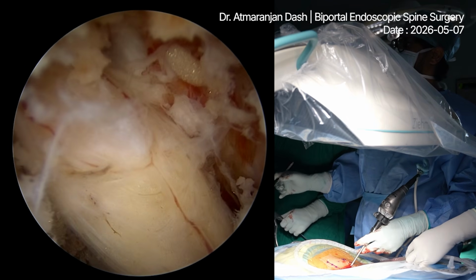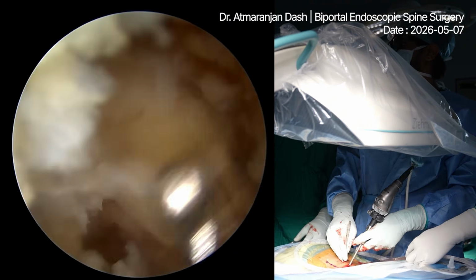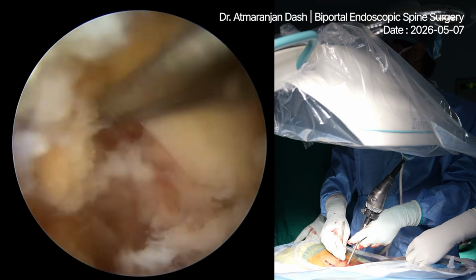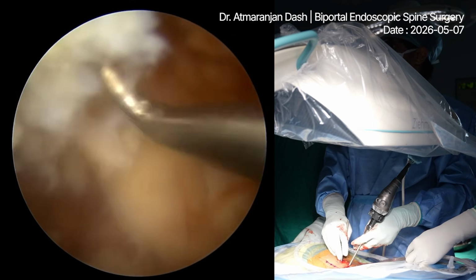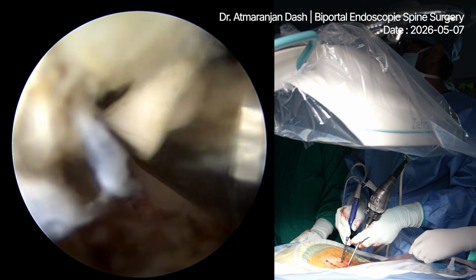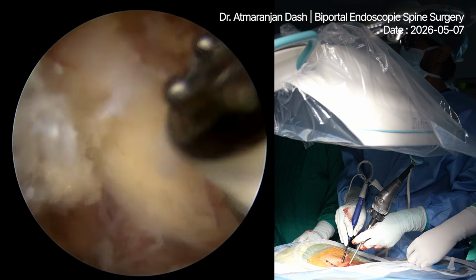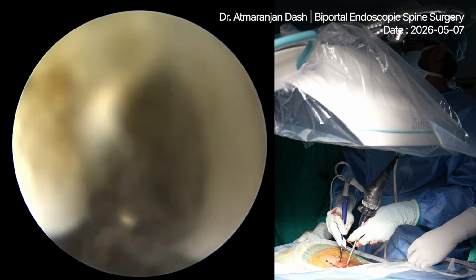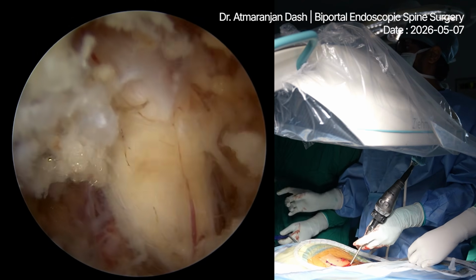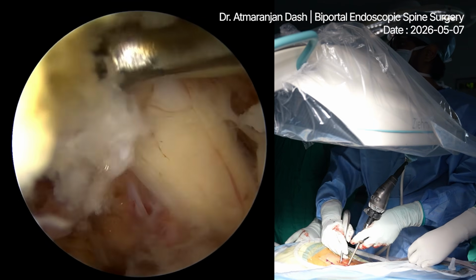Hook please. So this is the nerve. You should see whether the nerve is free or not first. Looks free now. Saline. Coagulation. Stop. Okay. Curette it. So we are seeing the nerve. This was an exposed nerve. You can see it is discolored, and the internal nerve is better now.